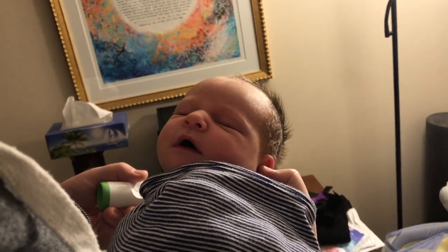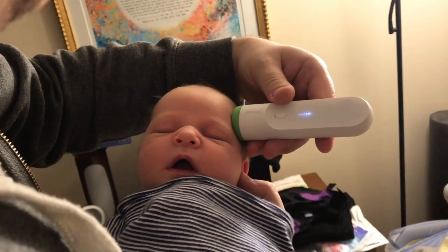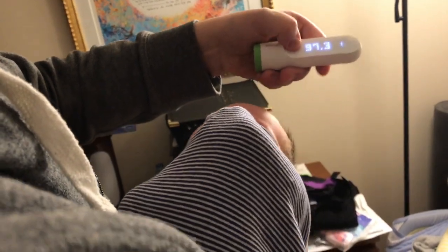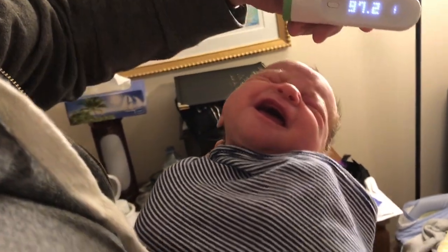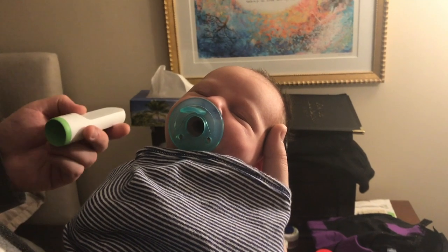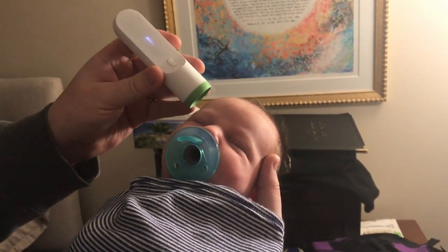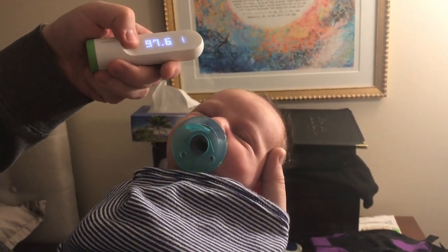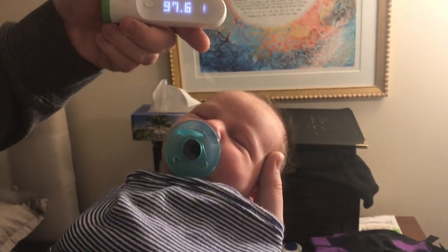Next up we've got Tech Baby. I'm going to do a couple measurements on her and try to get the same spot each time. There's a 97.3, and we'll do another one: 97.2. She's getting a bit worked up so she's going to put the pacifier in, and we're going to take those measurements from the other side now: 97.6, and same spot again: 97.6.